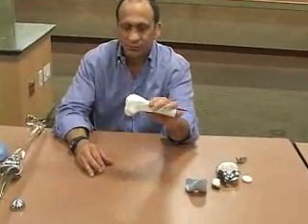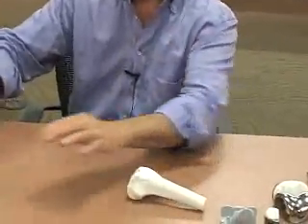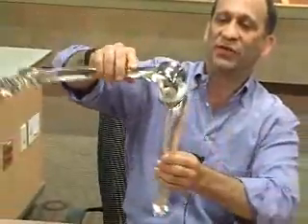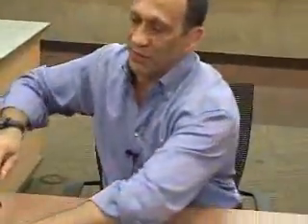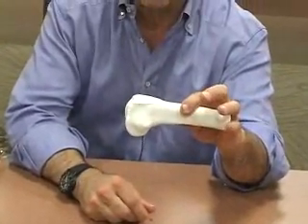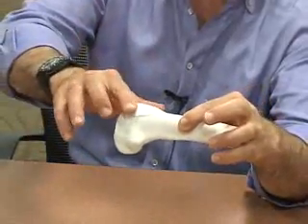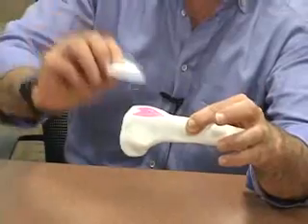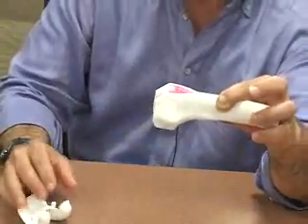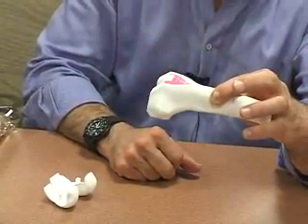And this is an example of a model of the end of the bone. This is the way a knee would work, just as an example to start out with. In this model, the cuts have been pre-made, and the knee is more of a surface replacement. So here are the cuts that we would normally make on a knee replacement. You just take a little sliver of bone off the top, and a little sliver of bone off the end. All the ligaments and the muscles that are surrounding the knee are left untouched.